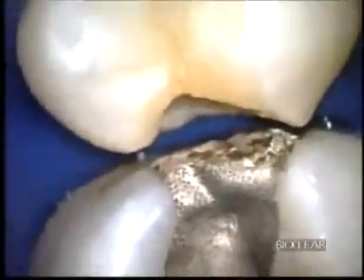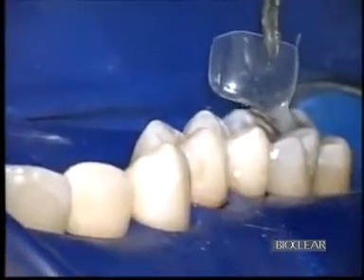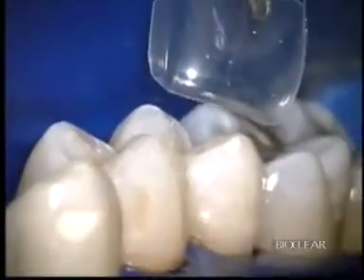So one of the things that I do after I finish the preparation is to clean the area aggressively with a lightning strip. Here I am placing a Bioclear average flat molar matrix. The bicuspid matrices will be available soon.